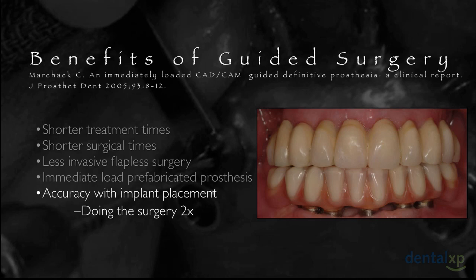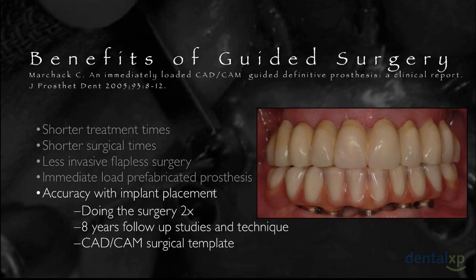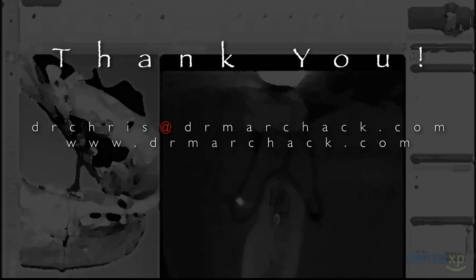But we have the ability to make a better diagnosis and understand the patient's anatomy with more understanding because of these three-dimensional acquisitions from cone beam CTs and three-dimensional software programs. We now have over 8 years of follow-up studies with this technique, with the CAD/CAM templates and the surgical templates, and with the surgical instrumentation.